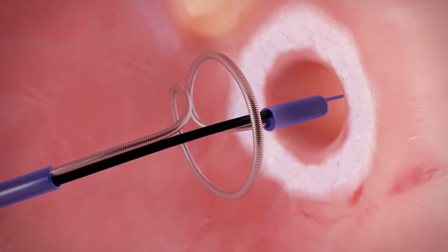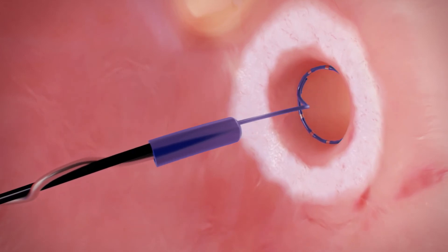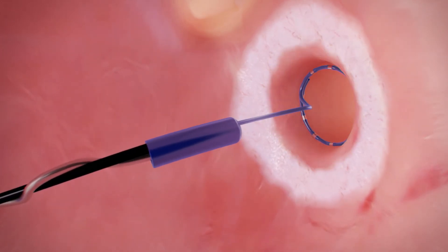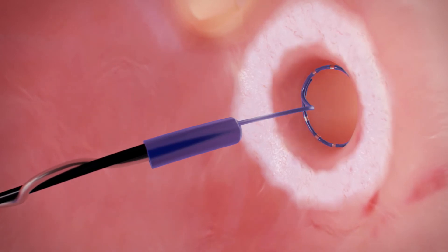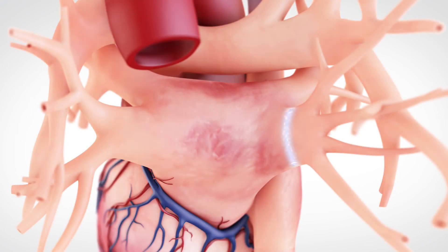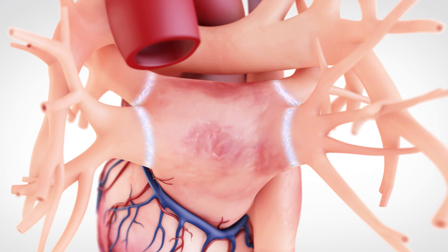Once cryoablation is completed, the mapping catheter is positioned to assess electrical isolation. Upon the physician's decision, additional freezes can be performed. By repositioning the catheter at each pulmonary vein, complete electrical isolation can be achieved.